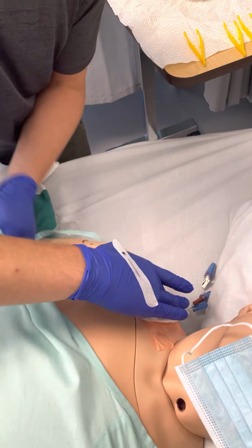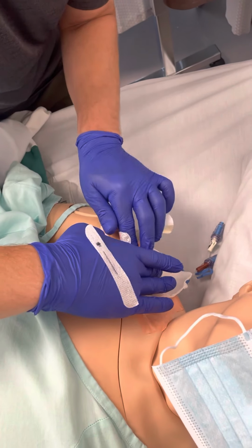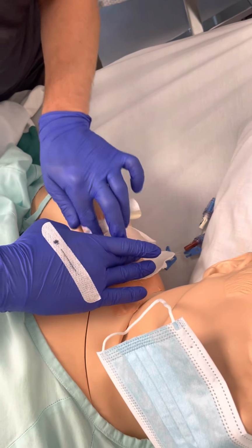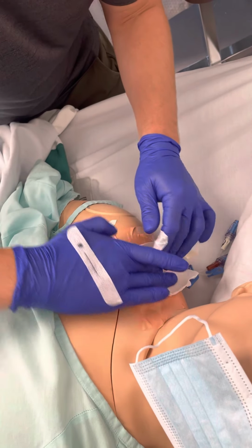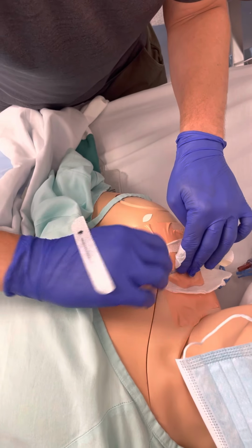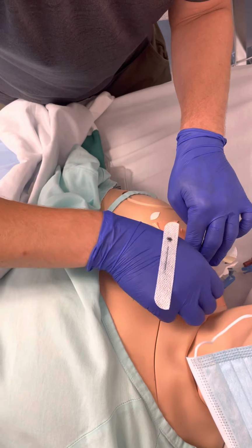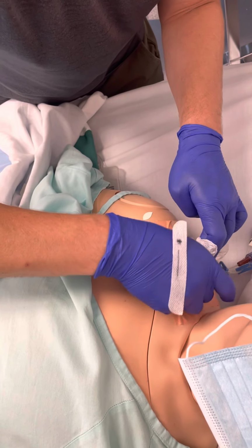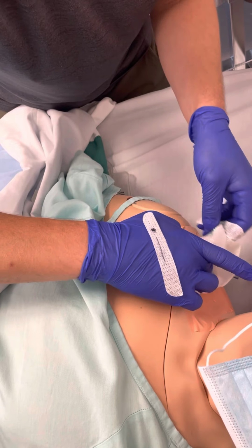Pull this down enough, but not too much that I'm securing more or exposing more than the CVAD. Good. And I'm mindful that I'm going towards the insertion site. Good.